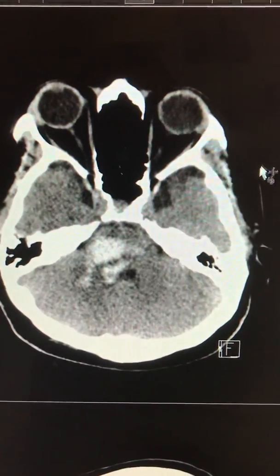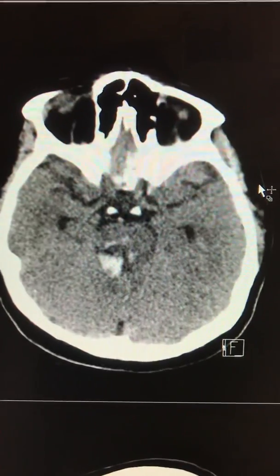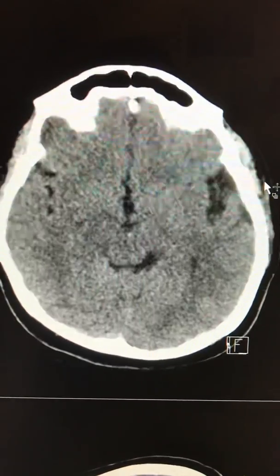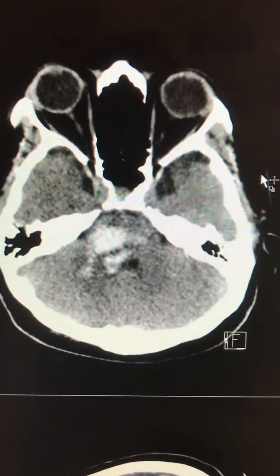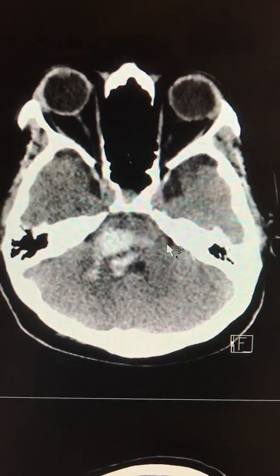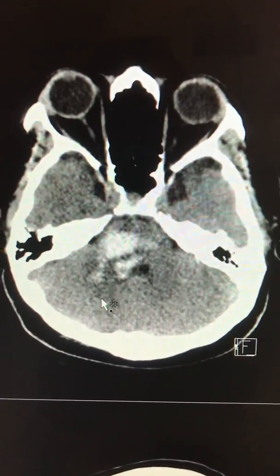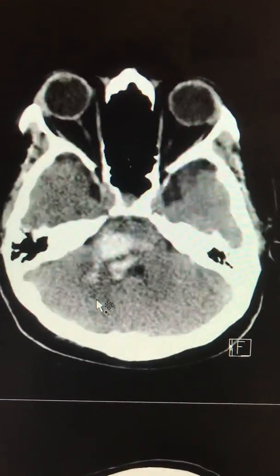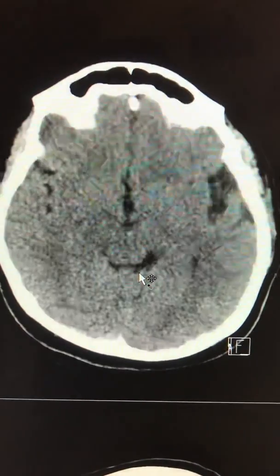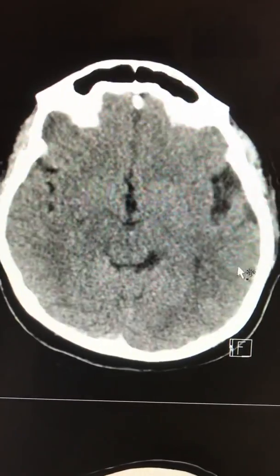This is a 40-year-old patient that presented as a referral to our hospital with coma and quadriparesis. The CT scan is showing a large area of hyperdensity within the brainstem involving the pons and moving upwards towards the tectum. You see that the fourth ventricle is not majorly compressed, and you don't see associated subarachnoid hemorrhage or significant intraventricular hemorrhage.